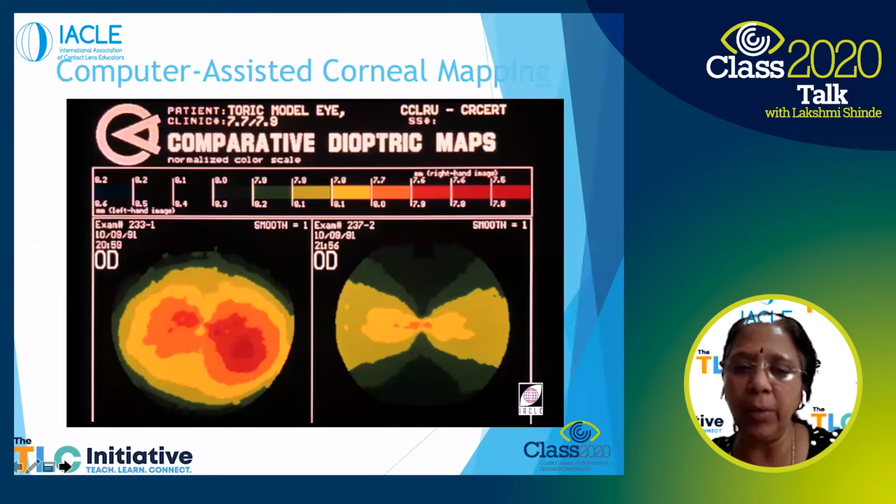Of course, nowadays we do have the computer assisted map rather than the keratometer, which gives us much more information than compared to a keratometer, and it also helps us in looking at things like keratoconus and other kinds of abnormalities where the cylindrical prescriptions are slightly on the higher side or frequently changing for that matter. So we need to look at them, diagnose them early, and refer them properly to a proper type of contact lens rather than just a soft toric lens.